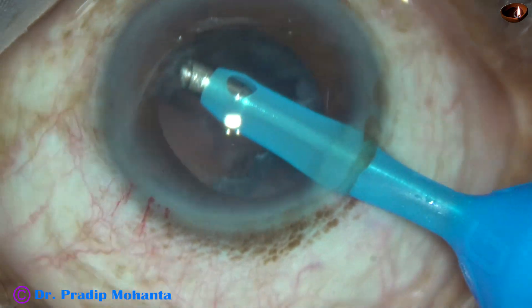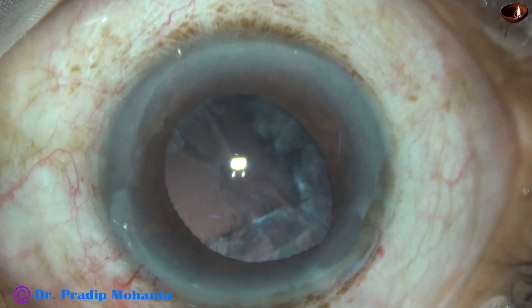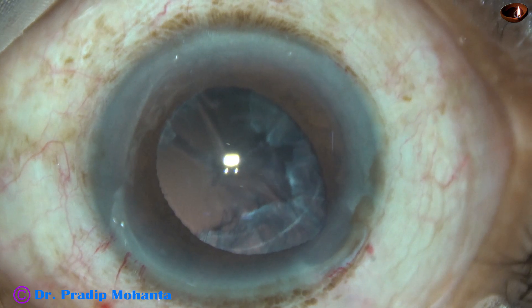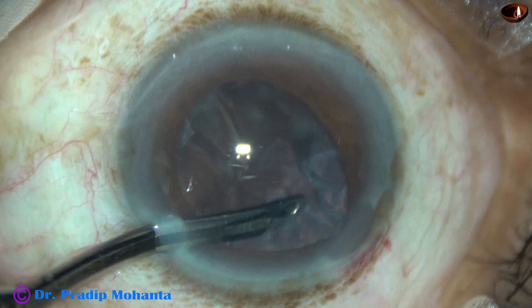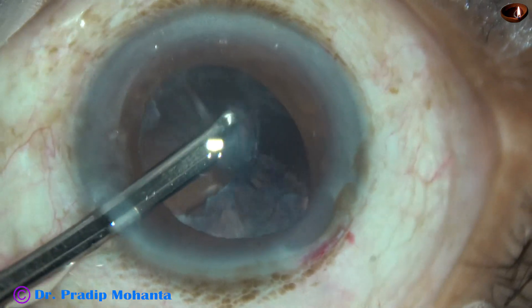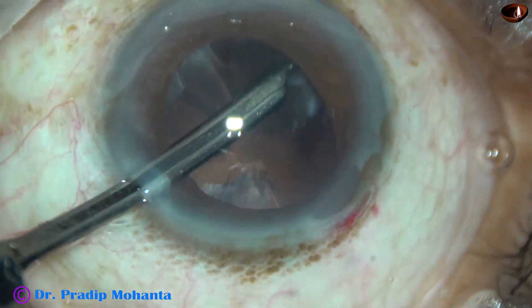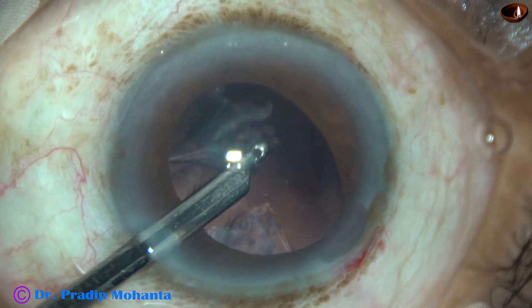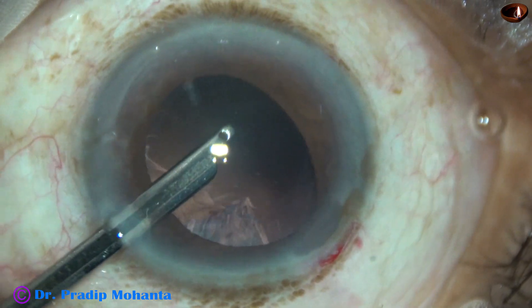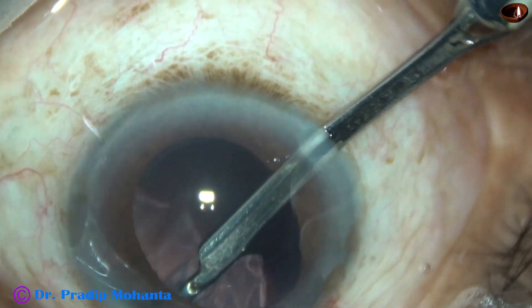I removed a part of the cortex by the probe itself. As I come out, the iris got incarcerated in the wound. I thought for a moment and decided not to reposition the iris — instead, I go through the side port and remove the cortex, specifically the sub-incisional cortex. The iris is retracted because it is incarcerated in the main wound, and I can see very clearly the sub-incisional cortex. Now I go through the other side port and remove the cortex from the other side.